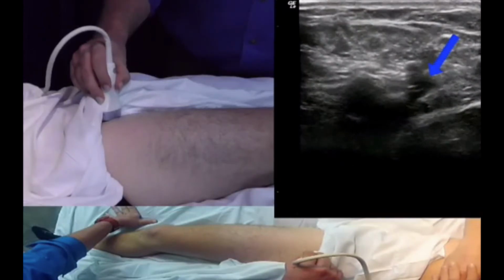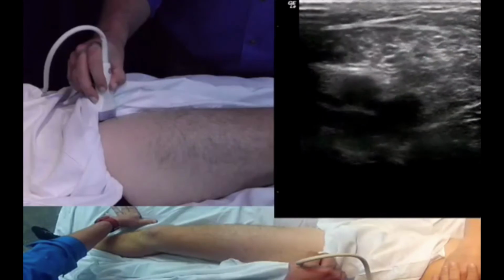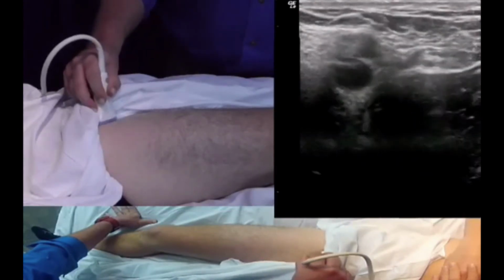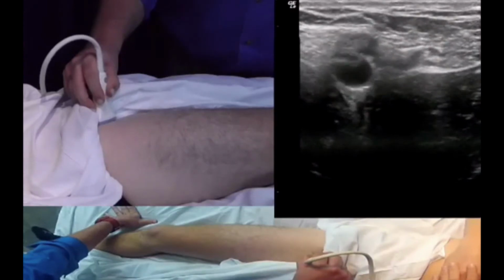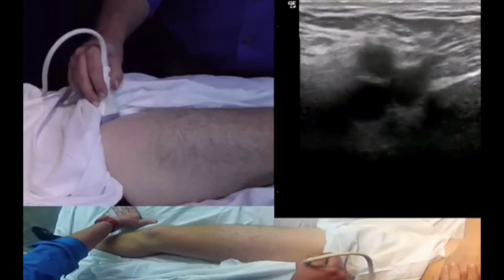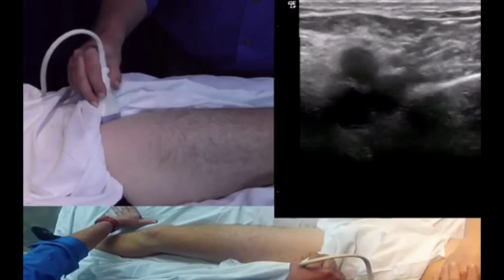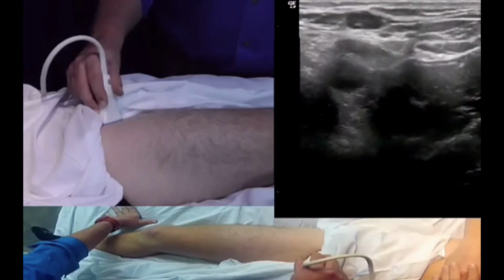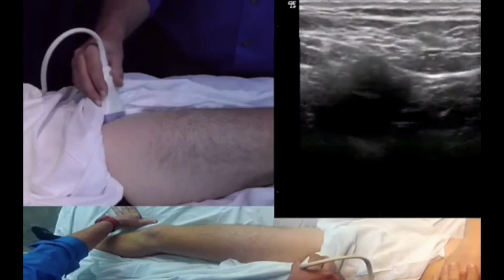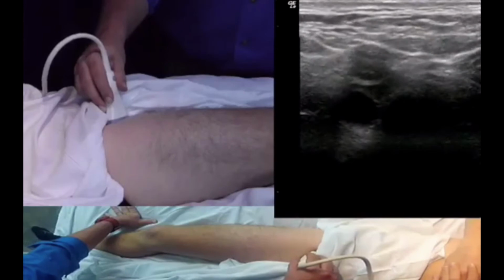We'll slide just above the confluence of the saphenous vein and the common femoral vein and compress. And you can see that the walls of the common femoral vein compress all the way down. We'll slide back down to the confluence of the saphenous vein and the common femoral vein, and we'll compress again. And we'll slide just below the confluence and compress one more time. And you see the walls of the common femoral vein are touching each other.